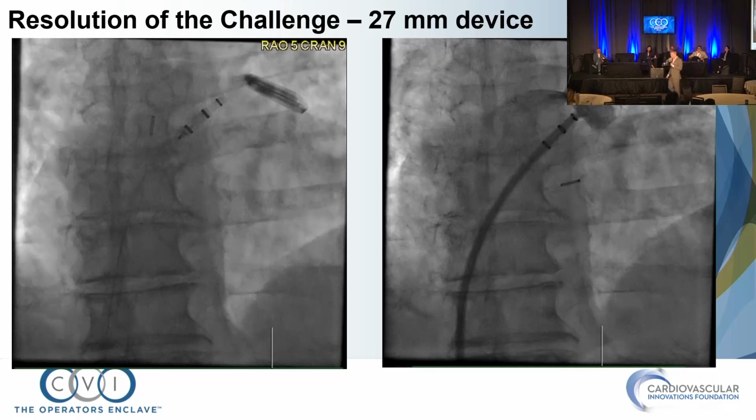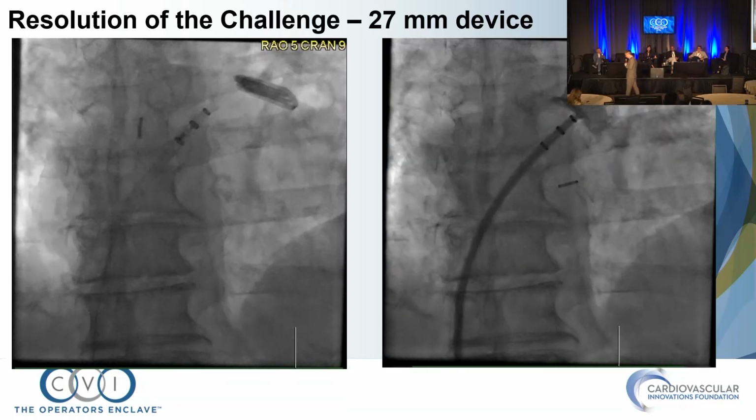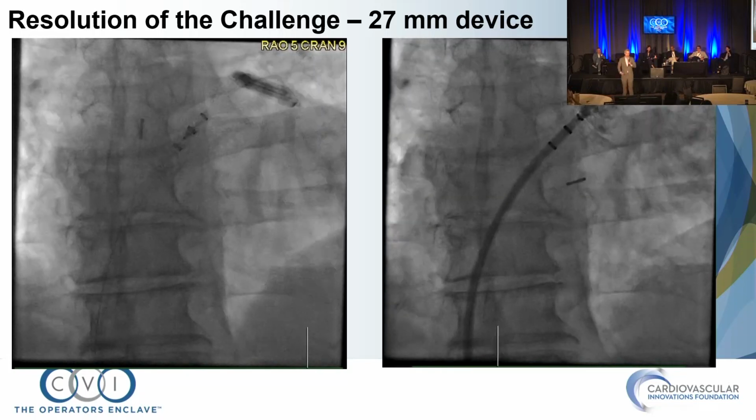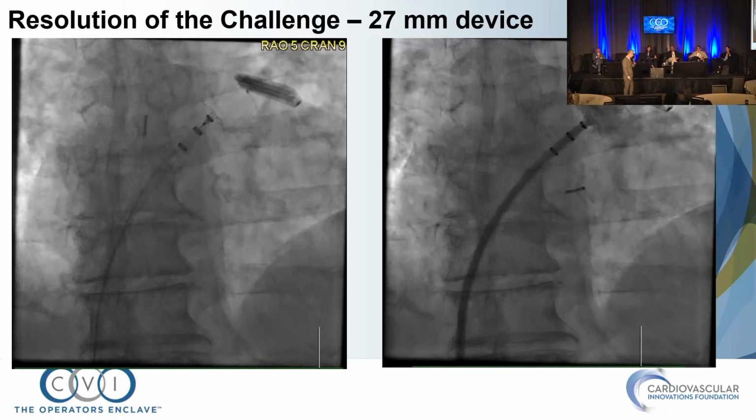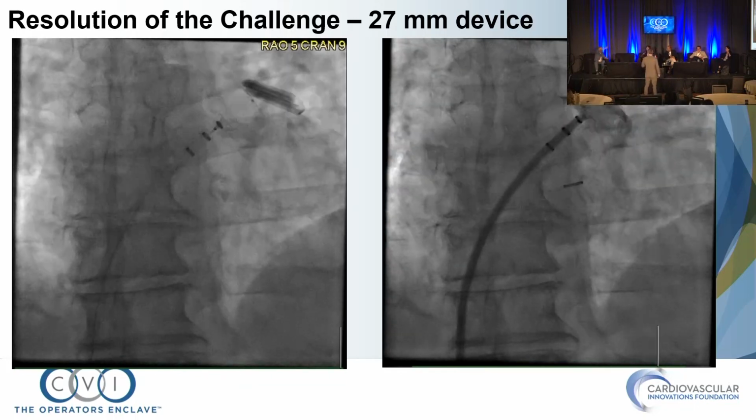We were about to give up. We didn't feel like going smaller was going to have enough diameter, but yet we were depth limited. And our center is really leaning heavily on CT for pre-planning. We do all of our planning with CT.